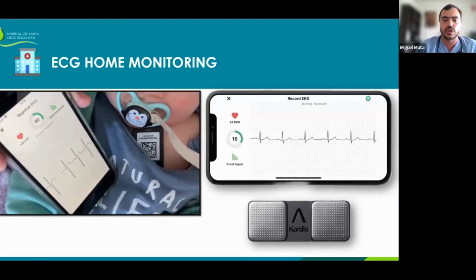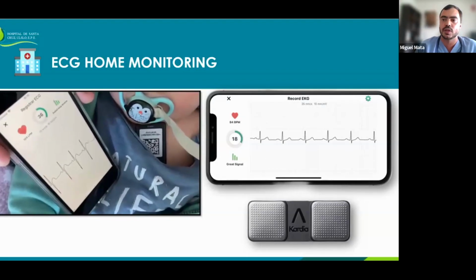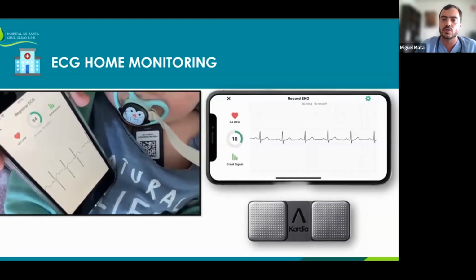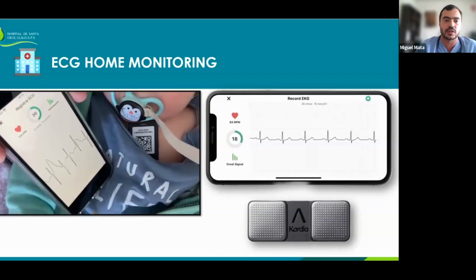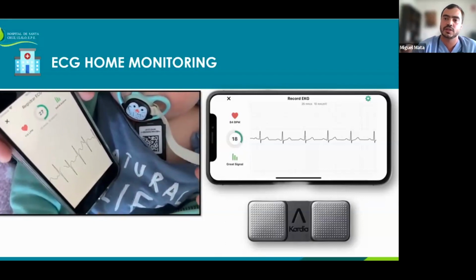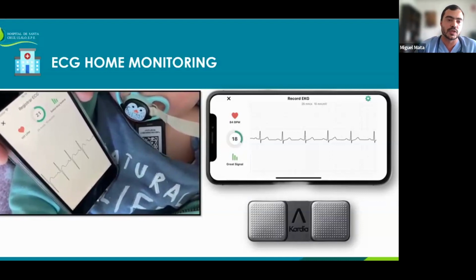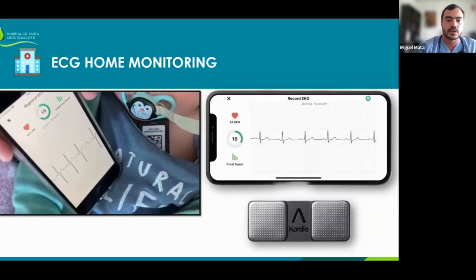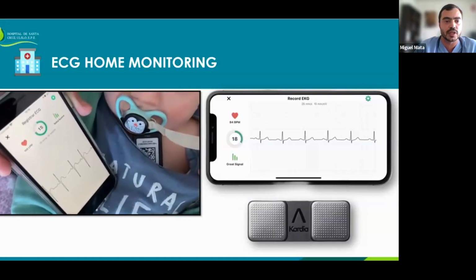And it's also good in terms of patient data security because the PDF is encrypted. So it's important to remember to share and to define a password in accordance with the parents. I, for once, use the letter A in small caps. So it's a small password because when they send you the ECGs, they will send them encrypted. So it's quite useful. Let's just finish the last 15 seconds so you can see the result.